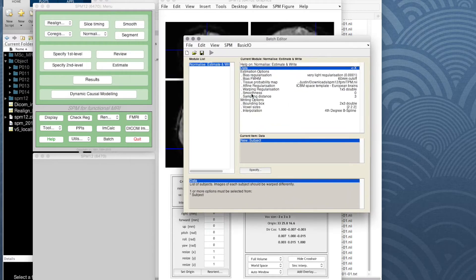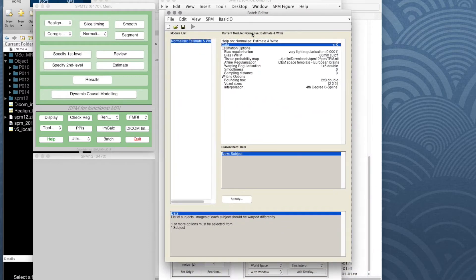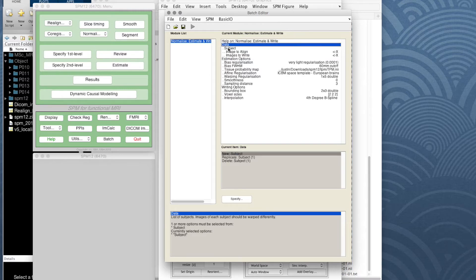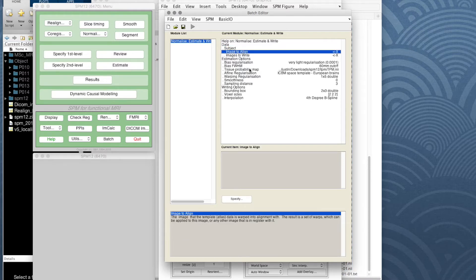This brings up the batch editor. We see lots of options and defaults for the normalization process which are quite complex, but we should be able to leave them as they are. First we have to put in the images we want to warp. The option here is new subject or participant, so let's put one in. Under the subject heading it says 'image to align' — the image that the template or atlas data is warped into alignment with — the result is a set of warps.